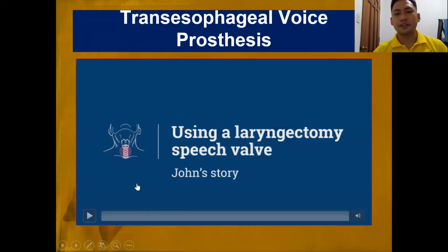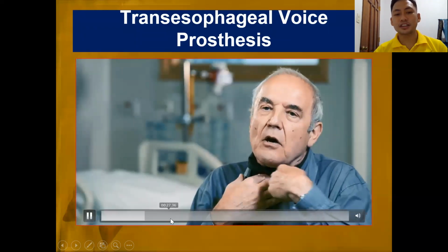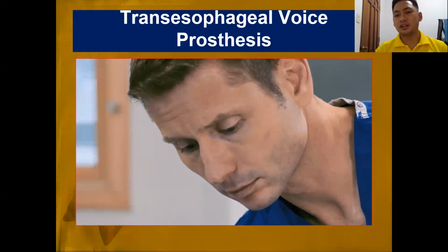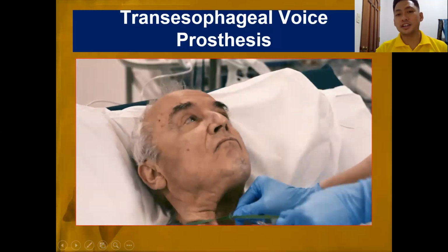And this is a transesophageal voice prosthesis. Ayan, may prosthesis yan sa loob. These are for patient with laryngeal cancer. Tinanggal na yung larynx. So this is also an alternative. The TEP, transesophageal voice prosthesis.